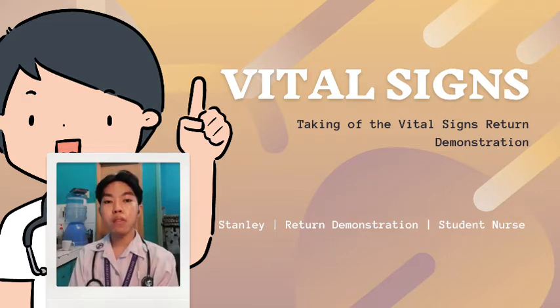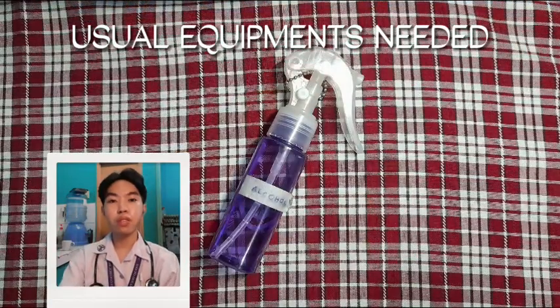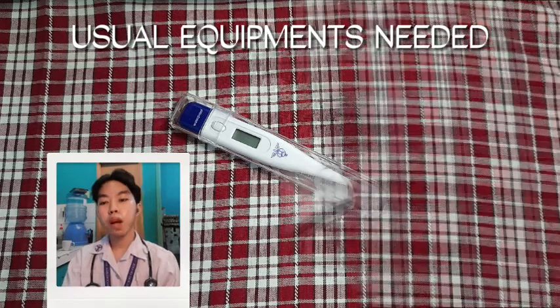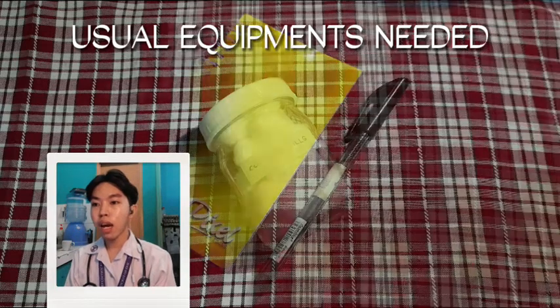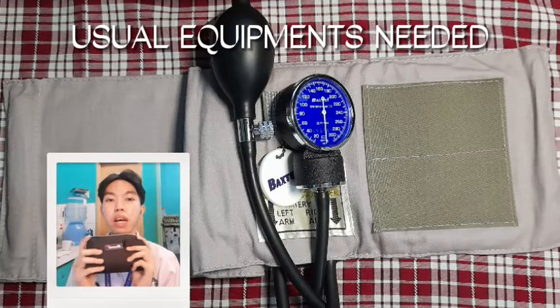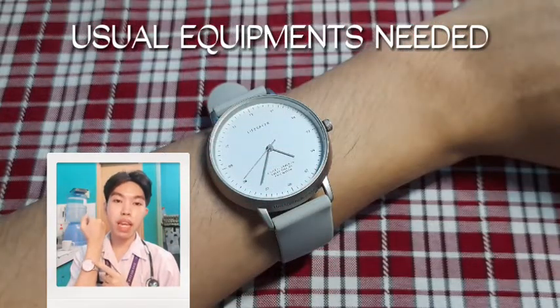Next is assessing the peripheral pulses, respiration, and also blood pressure. For the needed equipment: first, soap and a sink with clean running water for our medical hand washing. Hand sanitizer for hand sanitation and also for the sanitation of equipment. A thermometer — for this video I will be using the digital thermometer. Cotton pads or cotton balls with alcohol, or alcohol pads, to sanitize our equipment before, after, or even during the procedures. Pen and paper to jot down our data. For blood pressure: a sphygmomanometer and a stethoscope. And lastly, a wristwatch with a second hand.